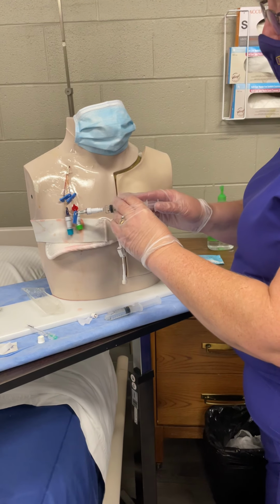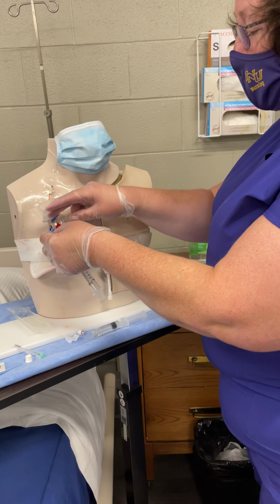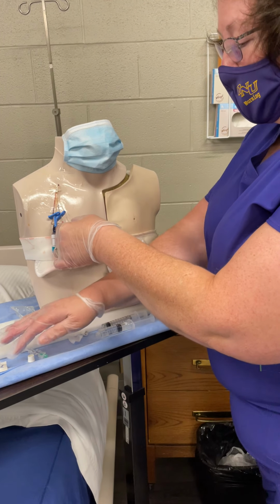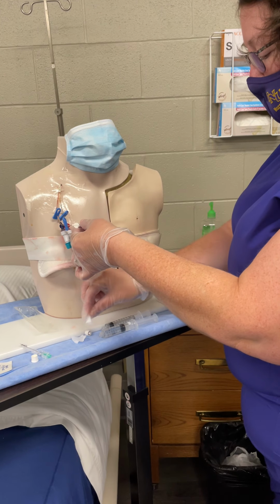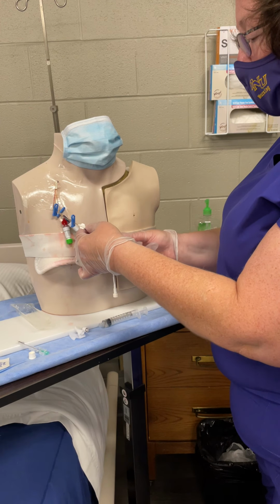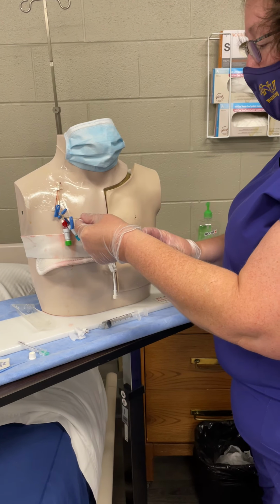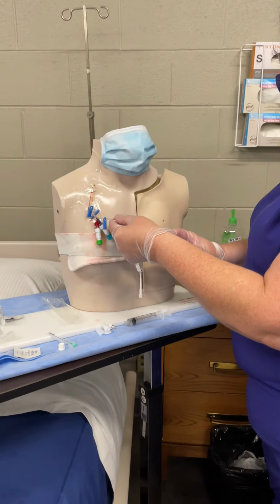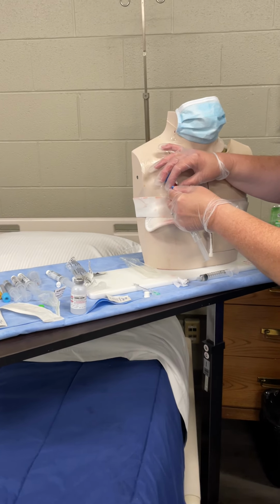All right. So we would give it over the 2 minutes. When that 2 minutes is done, we're going to clamp it. We're going to use a new alcohol pad. Scrub your hub, 10 to 15 seconds. Then we're going to use our new saline and flush it again. Now, if that person is getting other stuff through this line, then we're just going to use saline to flush. If they're not, then we would want to heparinize it. Okay? We're going to go ahead and clamp that.